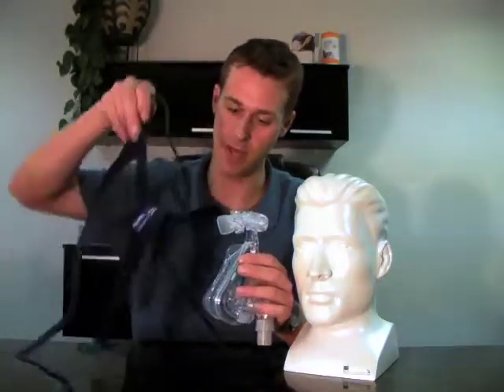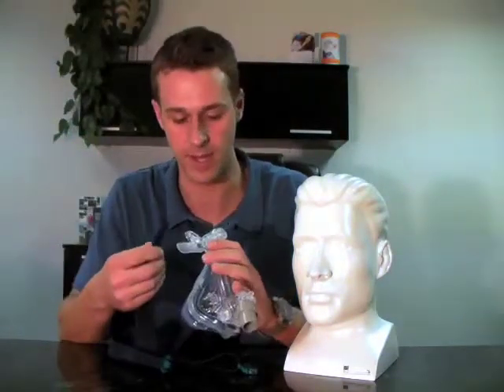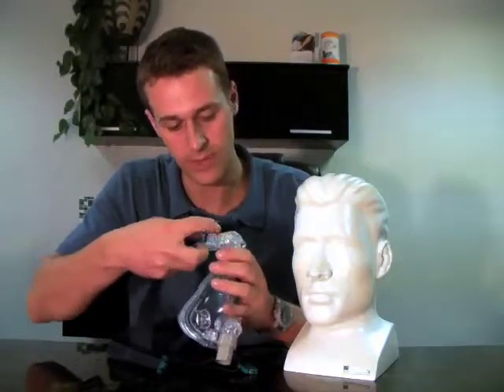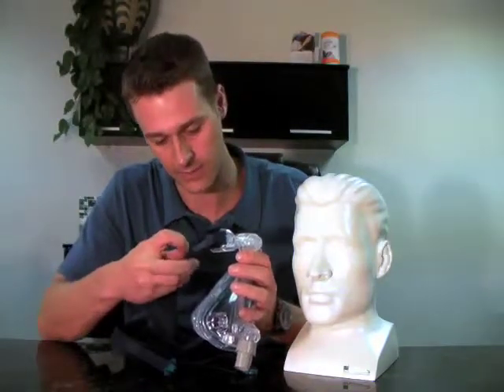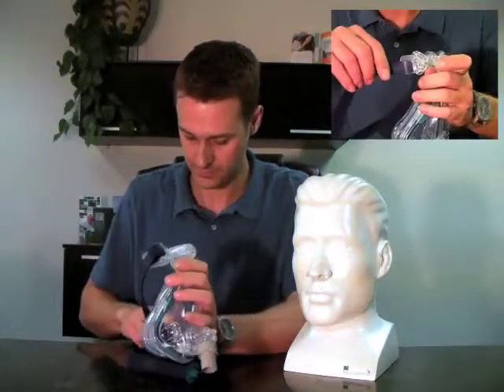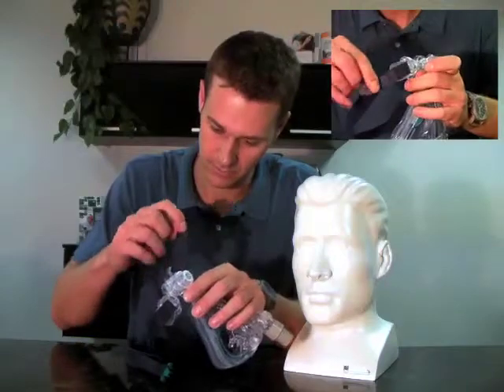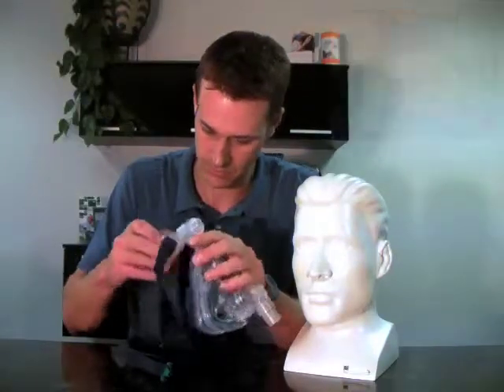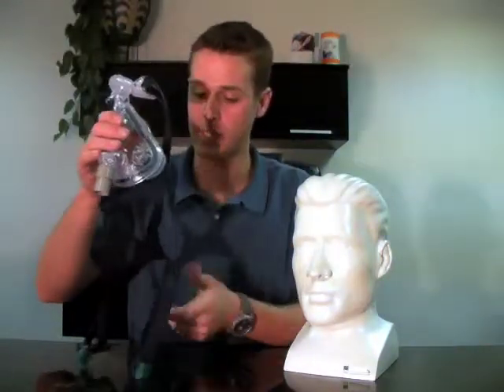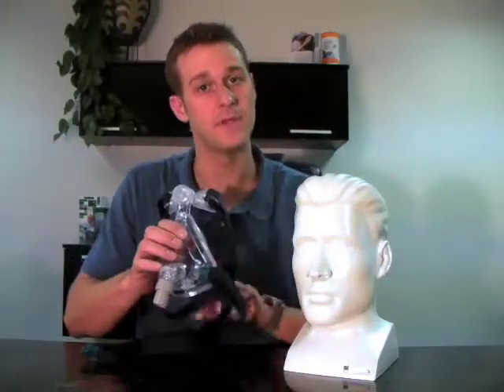The second piece of assembly will be putting the headgear into the right spot. The first thing that you want to do is loop the little velcro, which connects to itself, through the mask frame. Next you would want to take the clips and pop them in to the side.